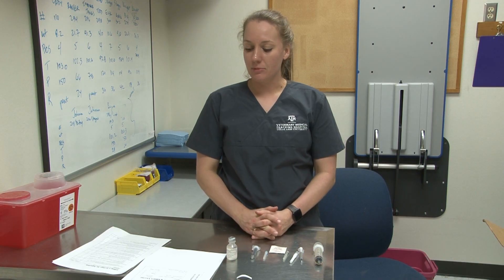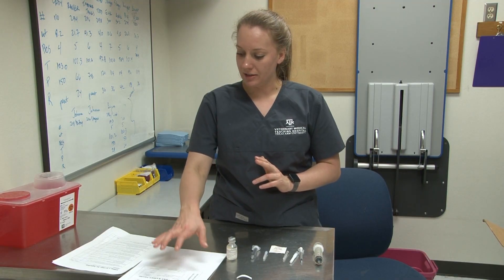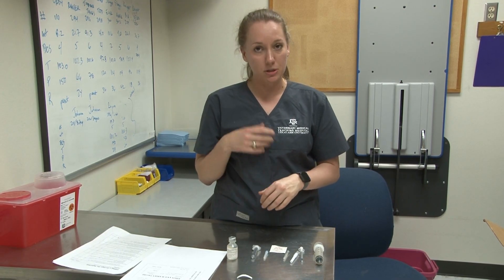Hi, I'm Sarah Kronberger. I am a small animal orthopedic technician here at the vet school. I am going to be showing you how to fill a syringe for an injection today. We have orders from a doctor that says we're going to be giving one cc of a rabies vaccine sub-q to Reveille.